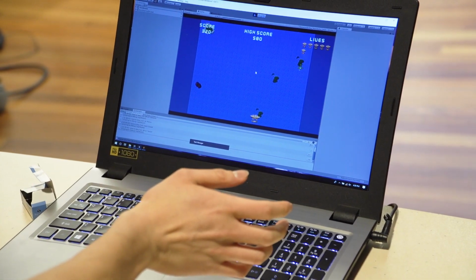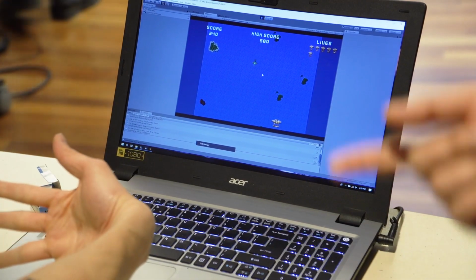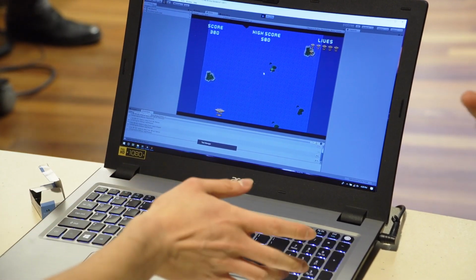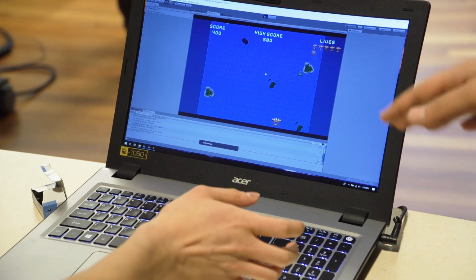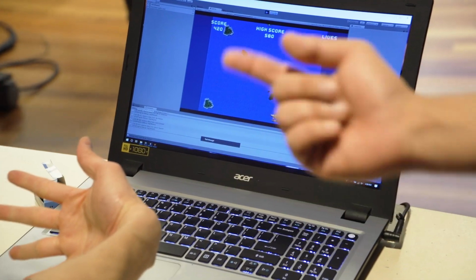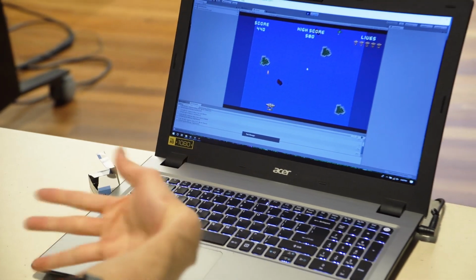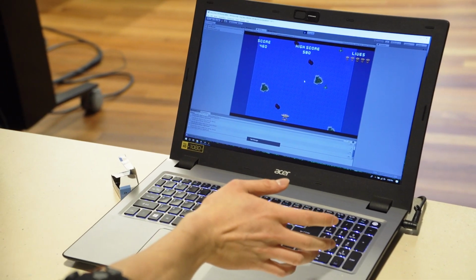Also, one thing to notice is that all the machine learning and all the processing is being done off the device. So it's like a cloudlet model. There is no compute on the sensor device itself. It's all done by a remote machine.